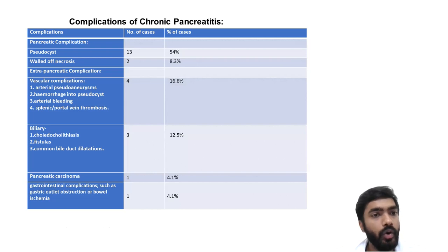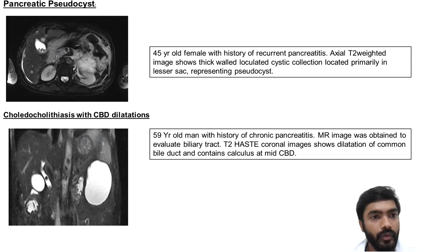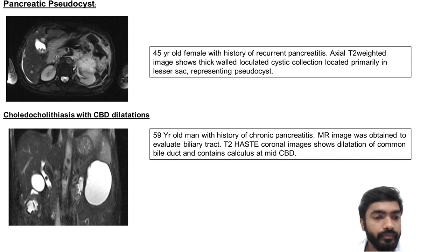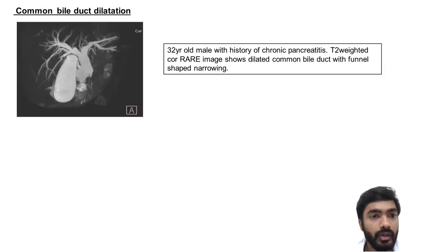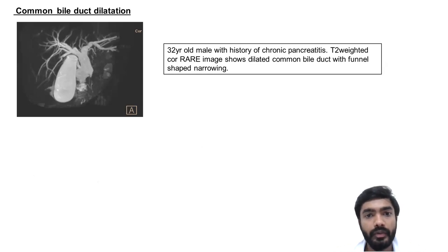Findings: pseudocyst in 13 patients, areas of necrosis in 2 patients, and extra-pancreatic complications including vascular complications in 4, biliary complications in 3, and pancreatic carcinoma in 1. A case of pancreatic pseudocyst with incidental gallstones and recurrent pancreatitis: axial T2-weighted image shows a thick-walled loculated cystic lesion in the lesser sac representing a pseudocyst. In a 59-year-old man with chronic pancreatitis, common bile duct dilatation with a stone was seen; coronal images show dilatation of the common bile duct containing a calculus. In another patient, T2-weighted images show dilated common bile duct with funnel-shaped narrowing.